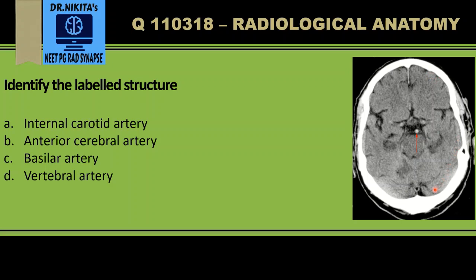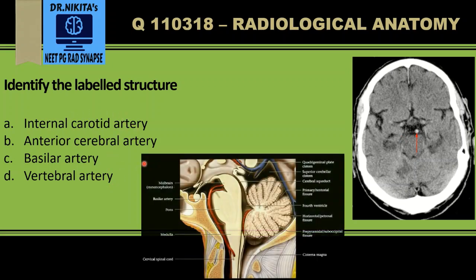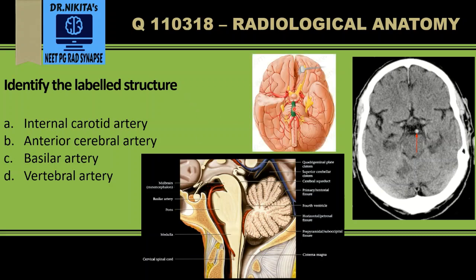Here we have a CT scan of the brain and we have to identify the labeled structure. This is one of the vessels, as we know from the options. Looking at the anatomy, the vessel which runs in front of the pons is the basilar artery. On the cross section, that is the pons, and in front of the pons is the basilar artery, formed by the fusion of two vertebral arteries.